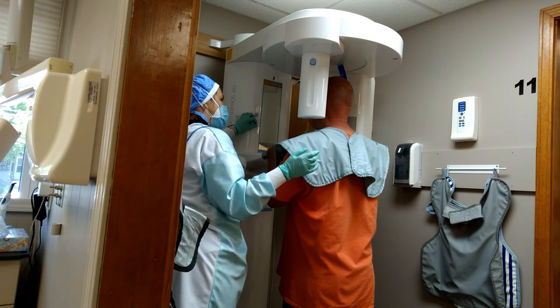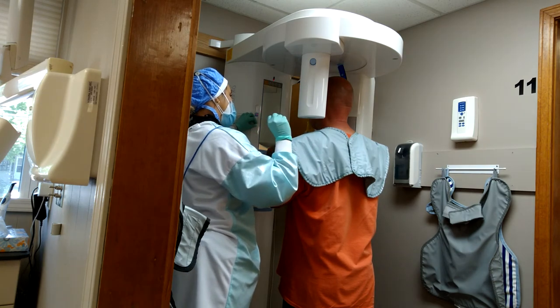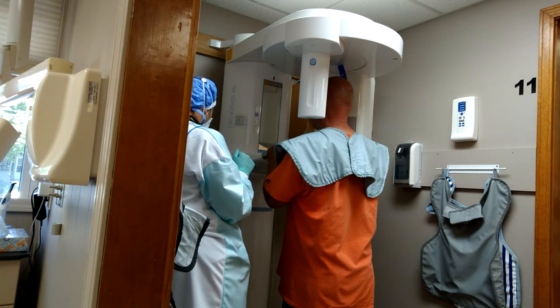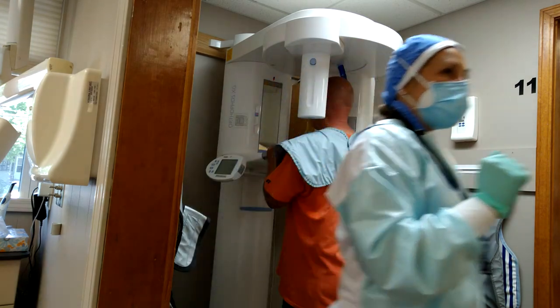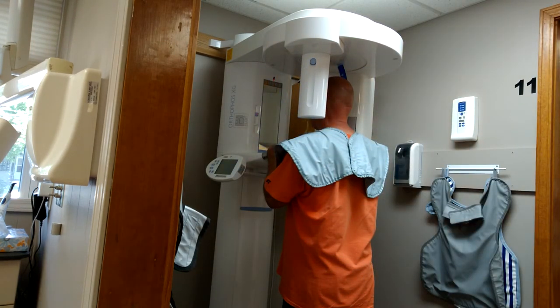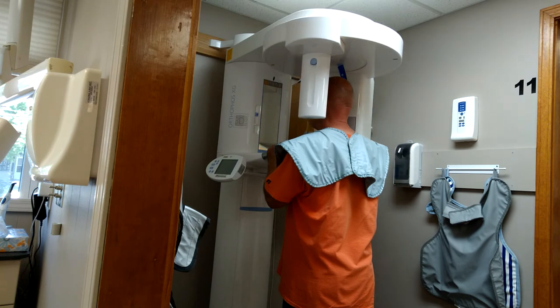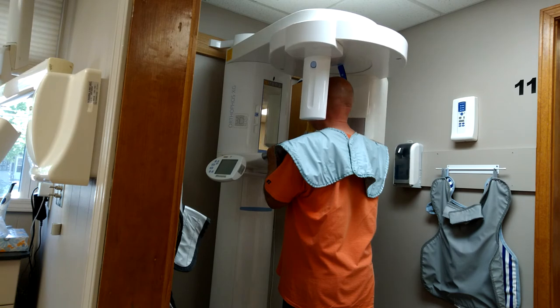Let's line them up. You're going to close your lips and keep your lips closed the whole time. Okay, this is just going to rotate all the way around. I'm going to push the button, so you're going to stay nice and still like a statue. Stand still — it'll make a loud beep noise.